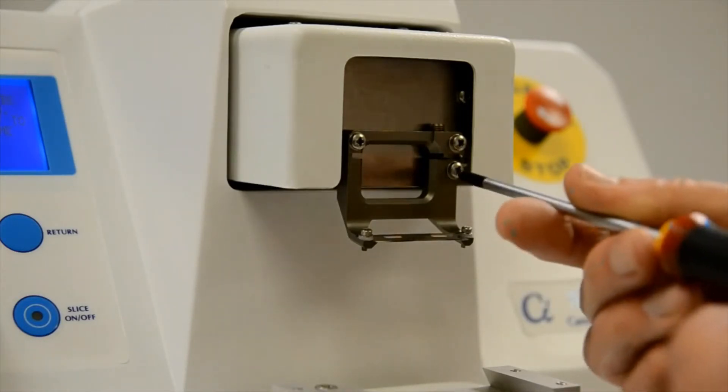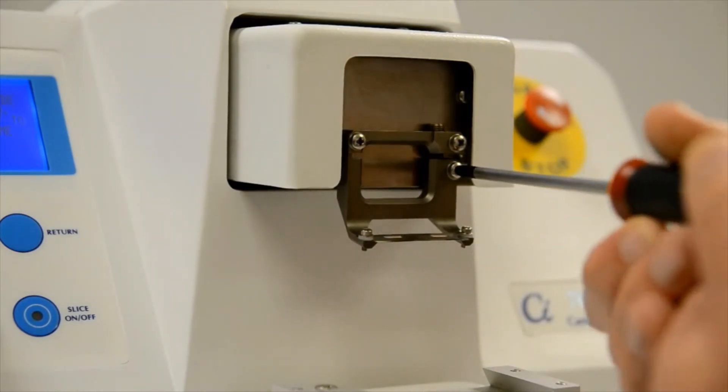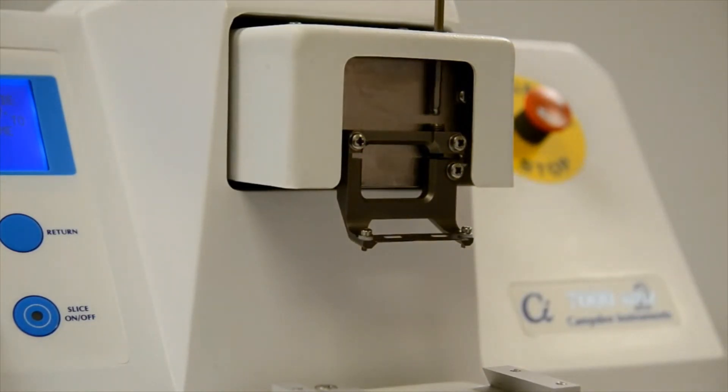So if you loosen the lower screw, the one on the right hand side of the blade holder, you will be able to use a hexagonal key to turn the differential screw and change the slot width.